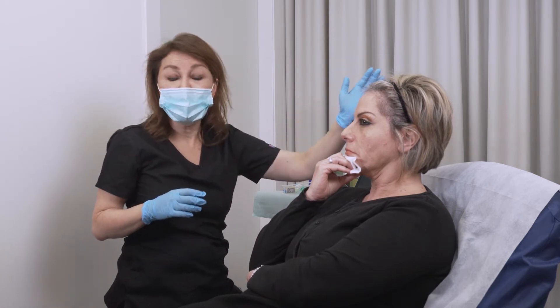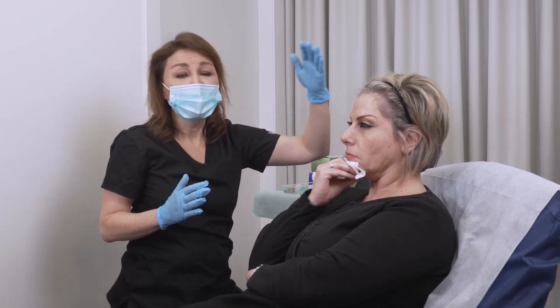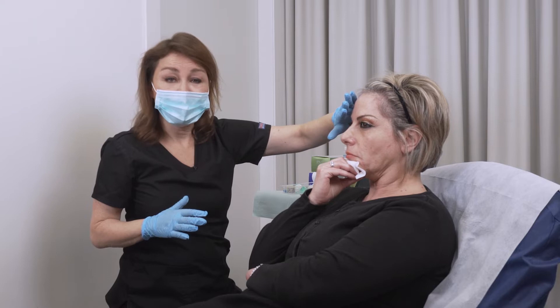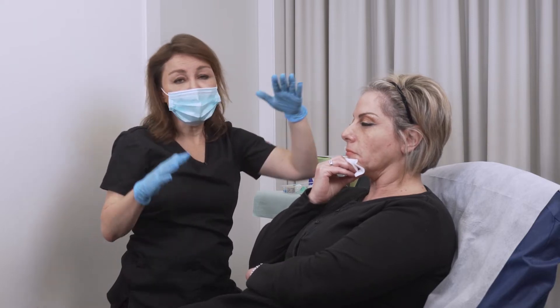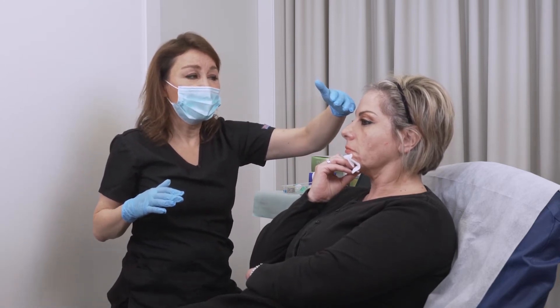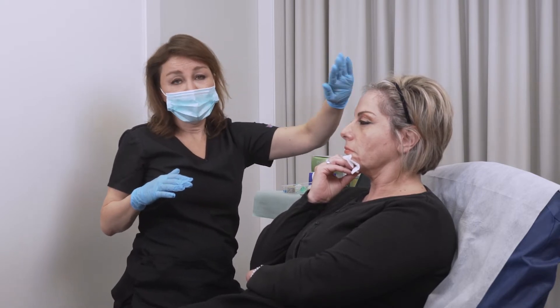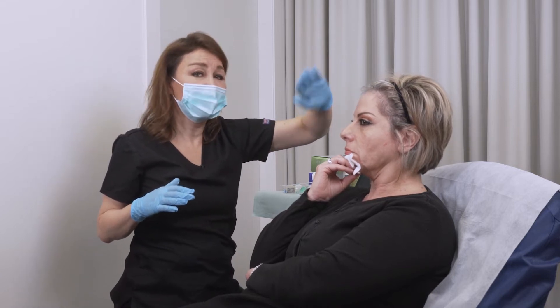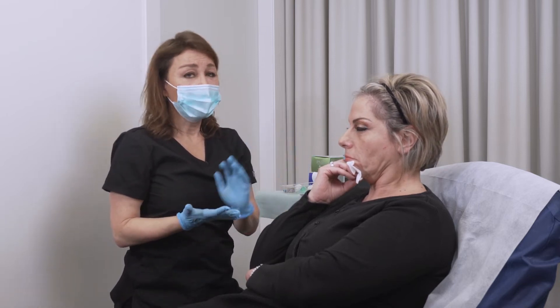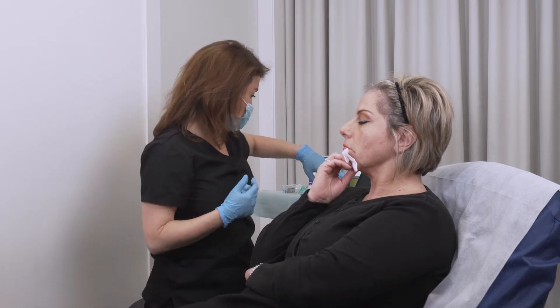We will map the supratrochlear and supraorbital arteries. These arteries change plane as they travel up toward the forehead — starting deep at the eyebrow level, then transitioning to superficial at around the lower fifth of the forehead. When injecting the forehead, it is generally safer to go deep since the arteries tend to be more superficial, though this change of plane varies from patient to patient.